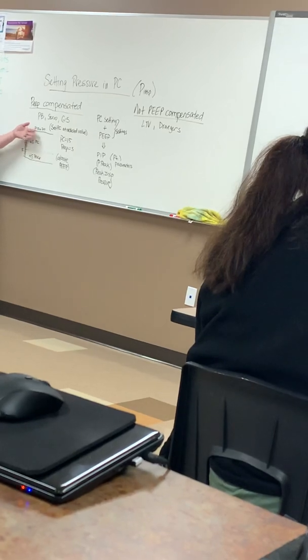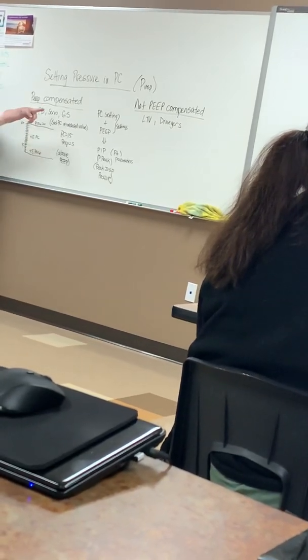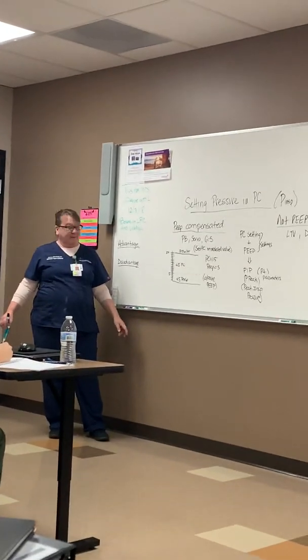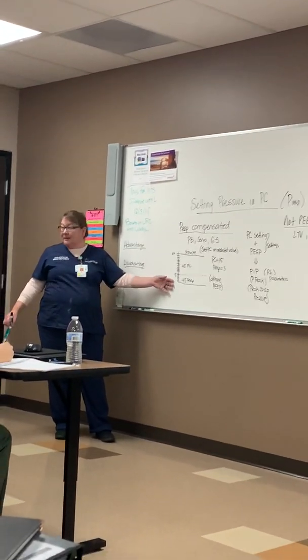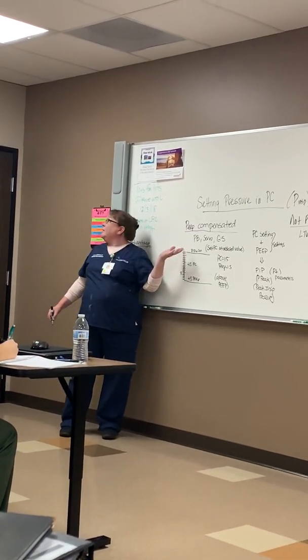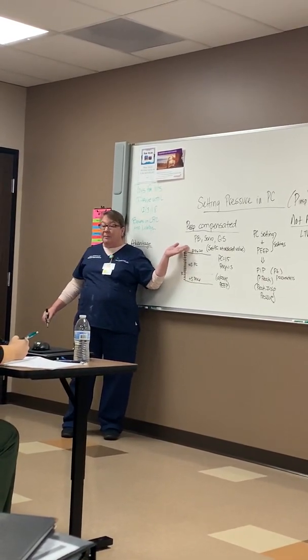I know you're like, why are you telling me this? Because these are different. Not PEEP compensated is different. So these are easy. Whatever number you want, it's what you put in. Also, just to cover it, people ask me, how do I know where to set my PIP?